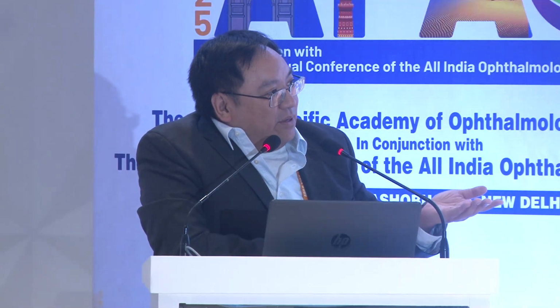So the way I see it is that we use the flow information to get what really is going on and what we really should be doing, but then it has to be reinterpreted as structure only. That structure and function has to be put together. That's why we had the outflow-specific AS-OCT. We're going to try to take the flow information and then make it a matter of what the structure is that determines those flow patterns. And then we can all do AS-OCT before surgery, because that's reasonable, and follow up with AS-OCT as well. To really do the angiography by itself, I think routinely, is very difficult.